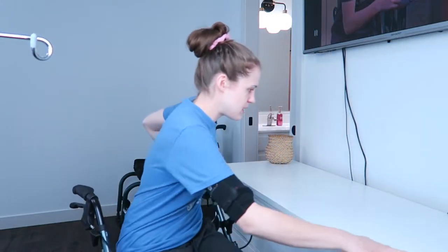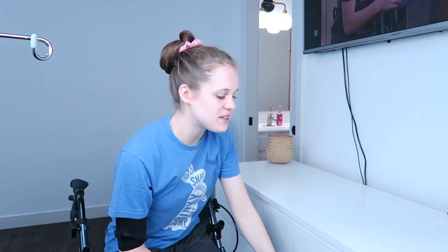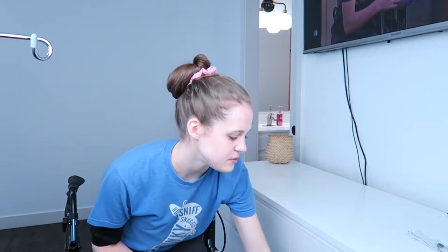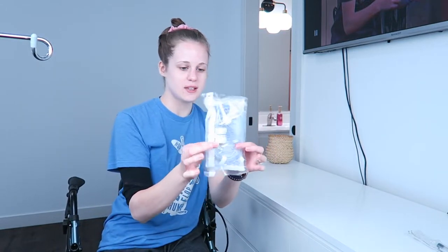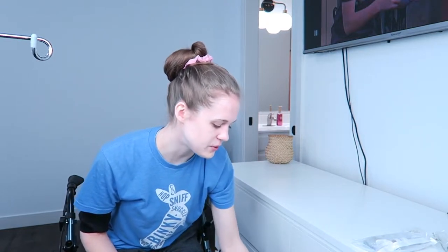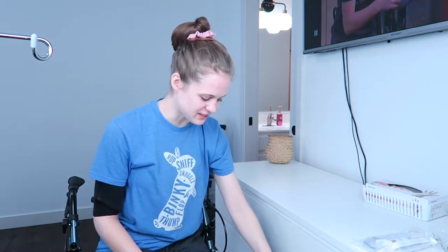And just wipe down the surface that I'm going to be using. So the first things we need are everything that I need for my infusions. So I'll need a saline flush to check for blood return before I hook up my fluids. I will also need a tubing for the fluids. I will need my gloves, which I'm actually just gonna take the whole container out. Oh my word, this hair is awful. Cannot believe I'm posting this on the internet.